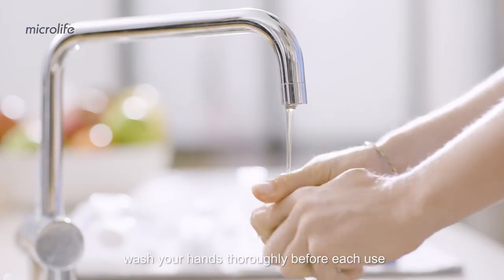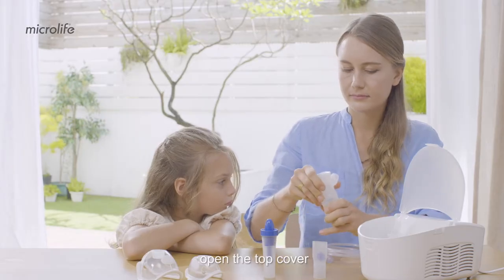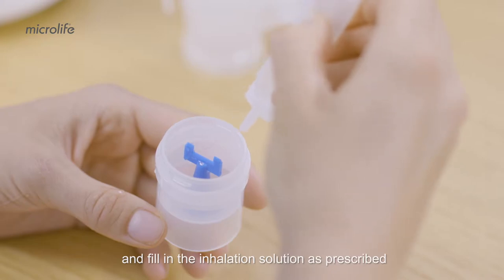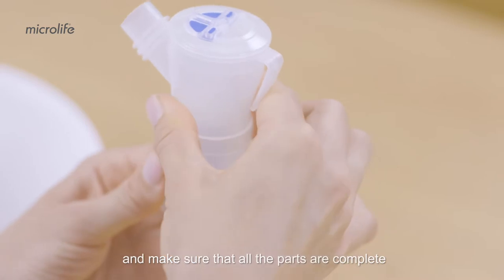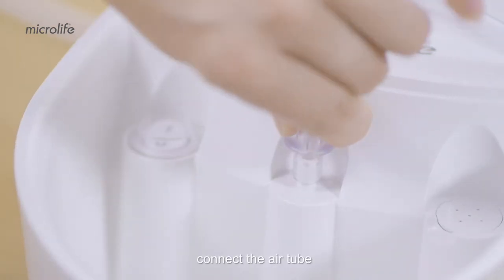Wash your hands thoroughly before each use. Open the top cover and fill in the inhalation solution as prescribed. Assemble the nebulizer kit and make sure that all the parts are complete. Connect the air tube.